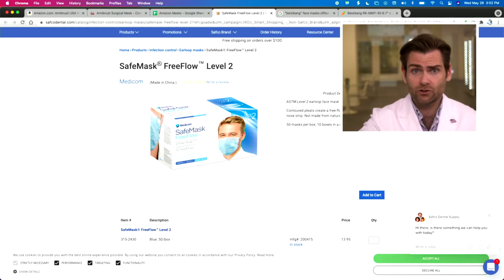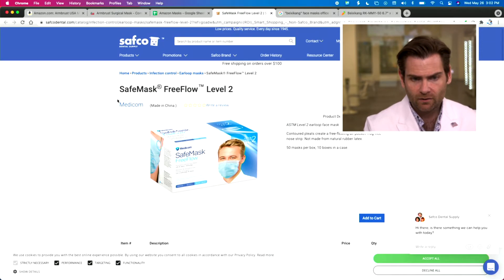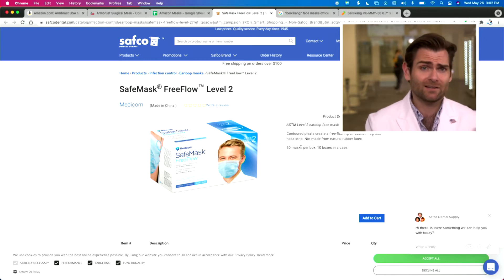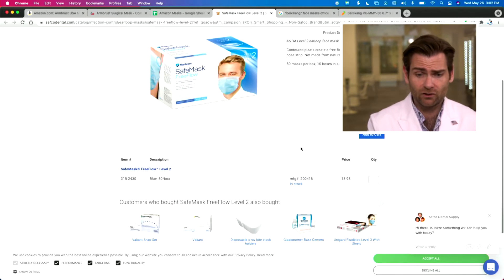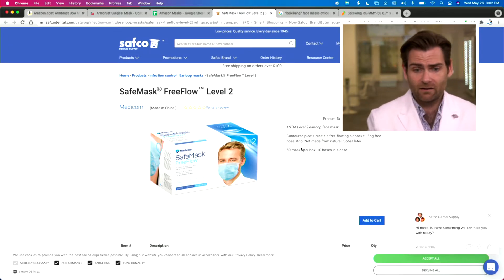We bought this on a website specifically because someone was telling me about how cool of a mask this was. I'll show you in a second, but I do want to show you where we got it from: safcodental.com, SafeMask FreeFlow Level 2. It's made in China obviously, but it's a legit mask that's been around for a while. I think it's mostly for dentists and it's got some really cool features which I'm about to show you.